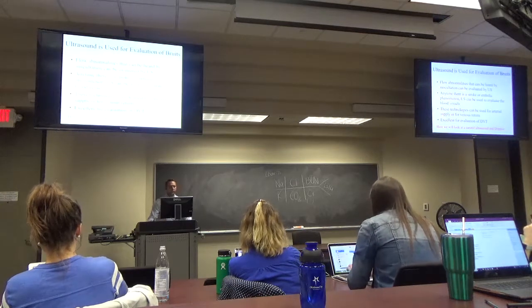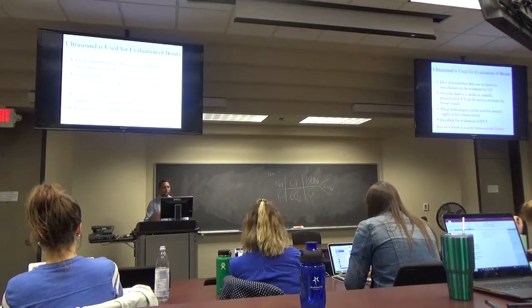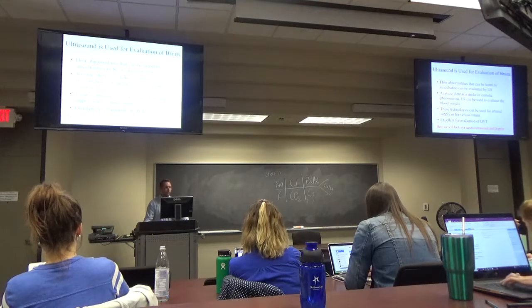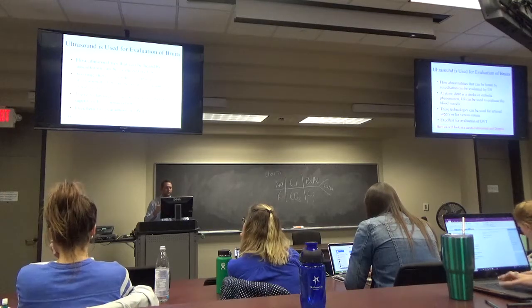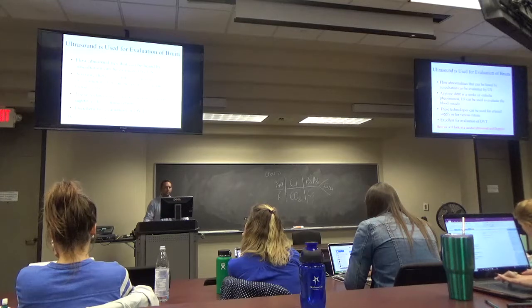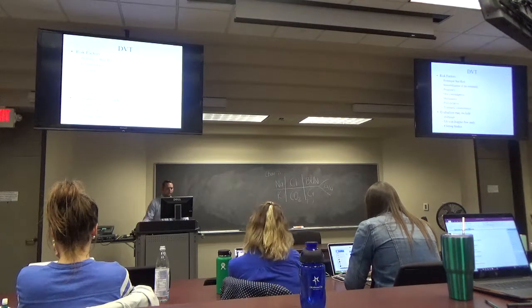So again, ultrasound is used for vessels the majority of the time. Whenever people are having strokes, you want to look at the carotid arteries, make sure the internal carotid arteries are not stenosed. That's one of the main things they do in stroke now.